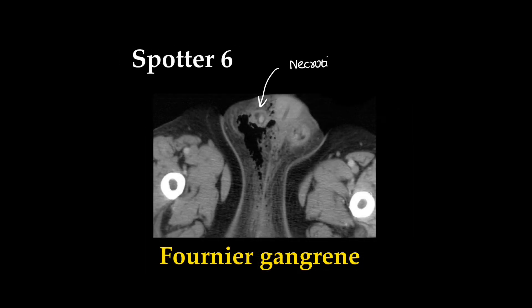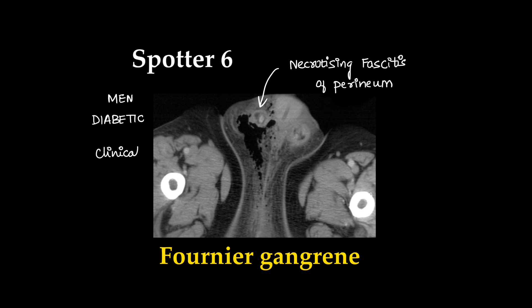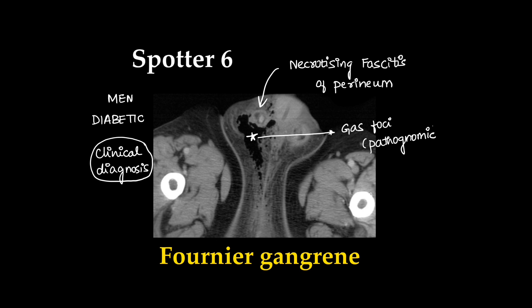This is a clinical diagnosis, nothing but necrotizing fasciitis of the perineum, most commonly occurring in men who are diabetic. Air foci are the pathognomonic features. Here we can see fat stranding also.